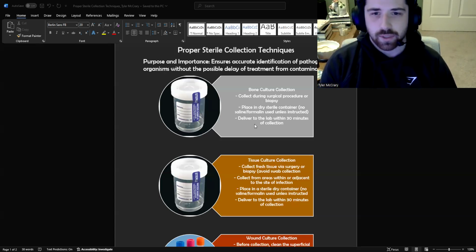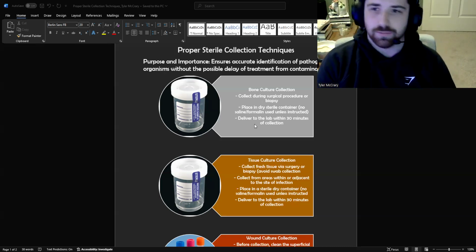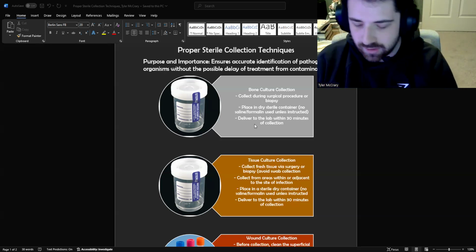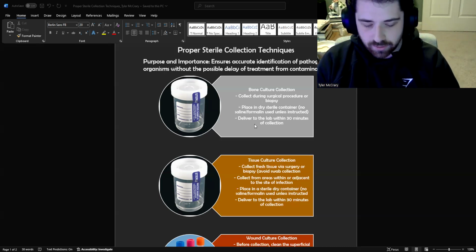in the lab, we can't necessarily reject the sample because it's not something that you can just recollect. They only have one bone, so you can't put it in for a recollect or anything. But here is an example of a container that they use for different types of bone cultures.